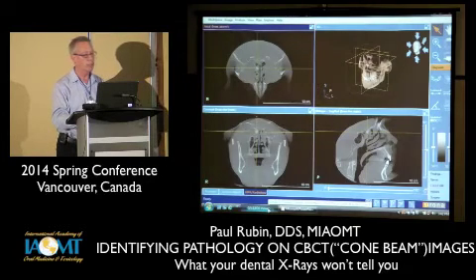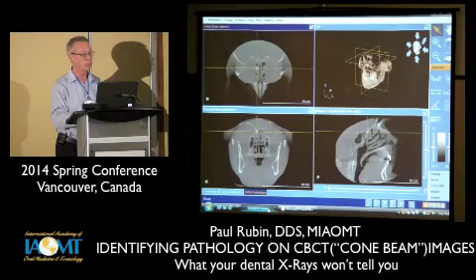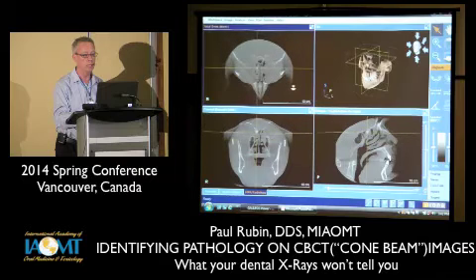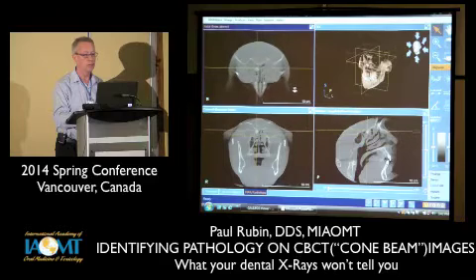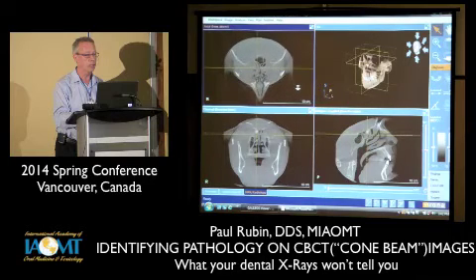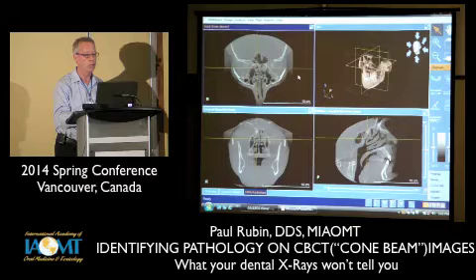When I'm looking at an image, I tend to start with this radiology view, which lets me look at the whole skull. If I go up to this view and start going up and down on my mouse, can you see on the upper right how that plane is going up and down? That orange plane. So when I'm looking at this upper left view, I'm scanning down from above, looking at what they would call an axial view. You get the concept there? Now we can make this larger.